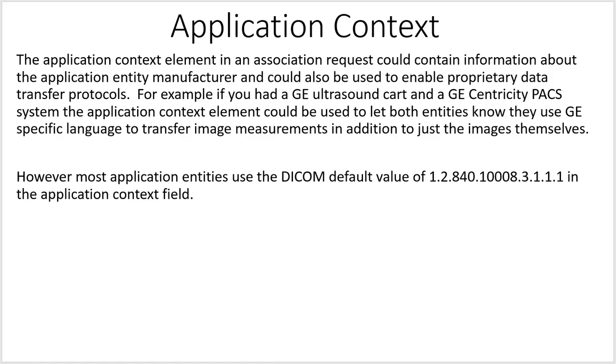However, most application entities use the DICOM default value of 1.2.840.10008.3.1.1.1 in the application context field. That is the default value that just says, hey, just use regular DICOM. We're not going to do any proprietary languages.